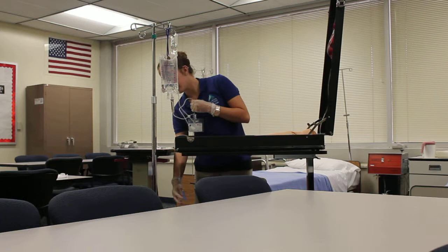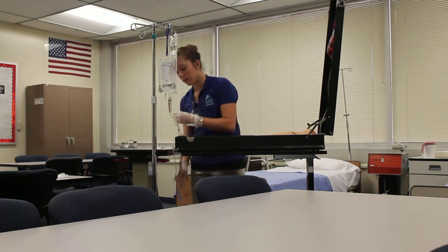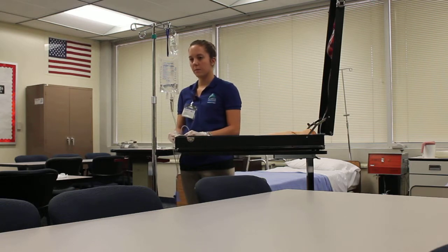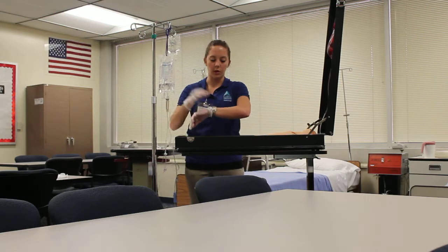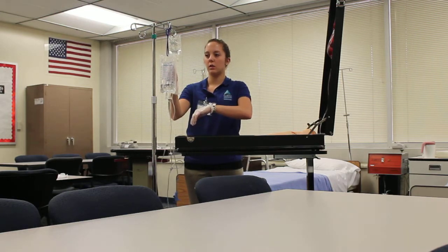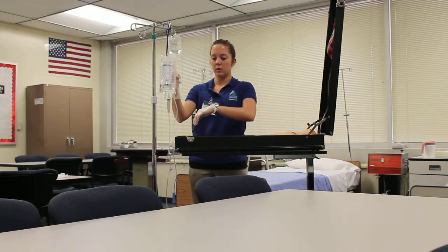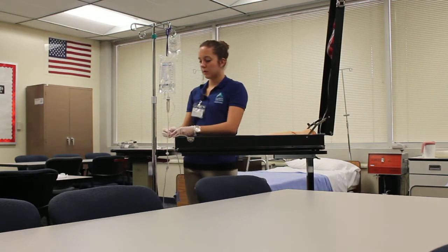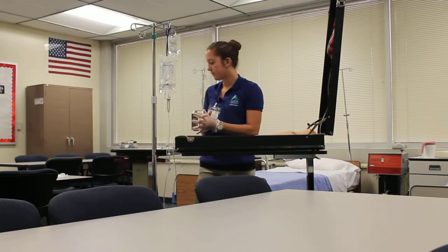I'm going to clamp my primary and unclamp my piggyback. I'm going to establish the flow rate, which I prior calculated to be 17 drops per minute. I'm going to use my watch. Once I've done that, I'm going to make sure it's unclamped fully. Clamp the primary. I'm going to let the medication run at this point.